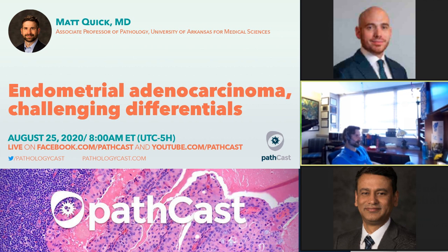And sometimes I think it's okay to say, you know what, I can't tell you if this is a metastasis versus synchronous primaries. There are lots of tools in our toolbox that we can use to point one way or the other. Certainly immunostains, some molecular findings, mismatch repair has been offered up, Vimentin staining has been offered up as potential things. And certainly they're worth trying. And you also want to pair that with your histology, right?